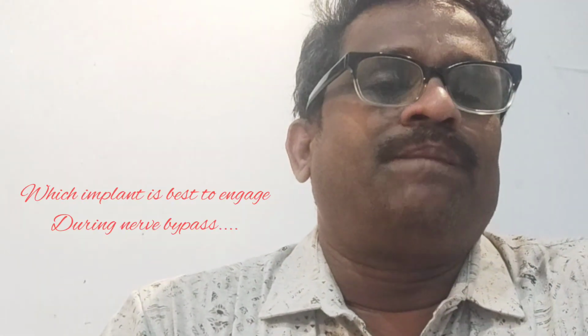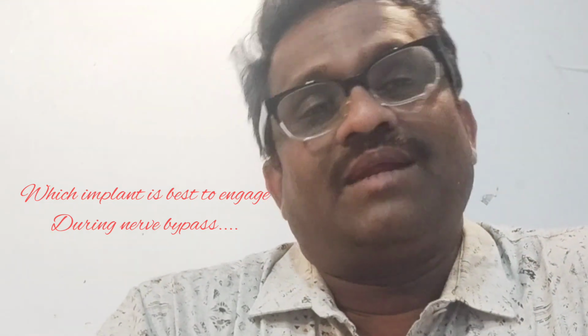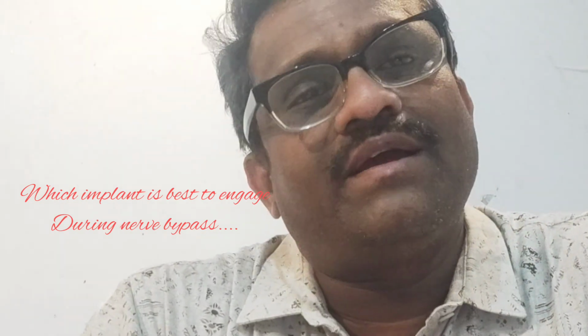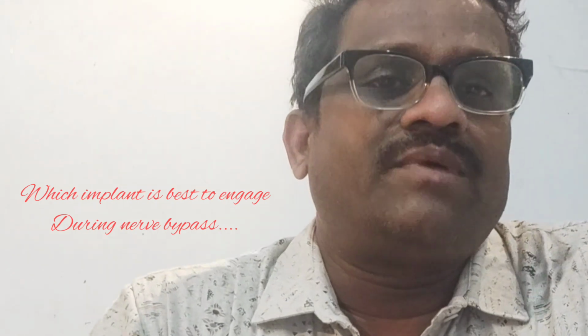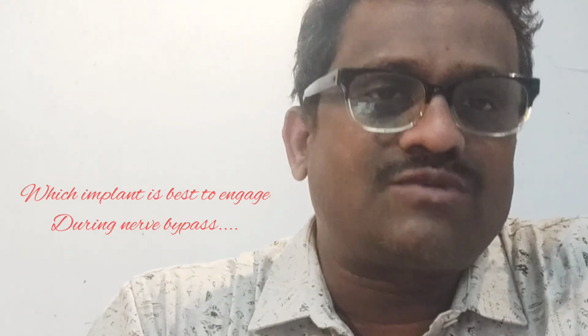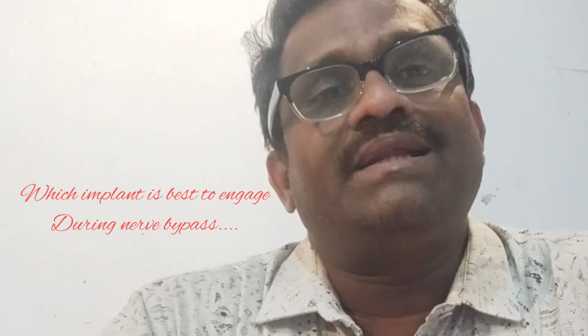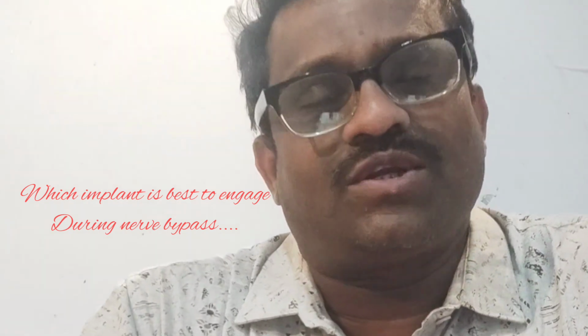If the distance from the crest to the superior border of the mandibular canal is around 10 mm or 12 mm, go for the compressive implant of 4 or 4.5 dia, or sometimes 3.6. In such cases you are going to do the lingual nerve bypass in the region of 4.5, 4.6, and also sometimes in the region of 4.4. When you do the nerve bypass using the compressive implant, you can bend the implant shaft neck along with the abutment to the prosthetic position. This is the advantage of using the compressive implant in the nerve bypass technique in the lower posterior mandible.